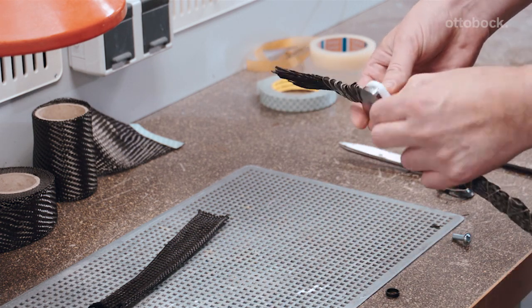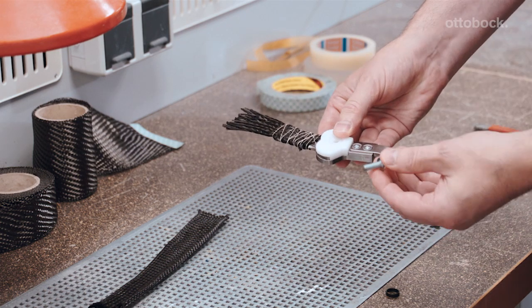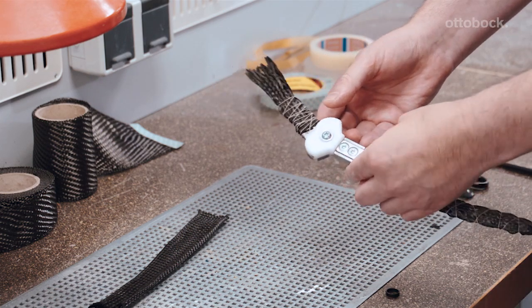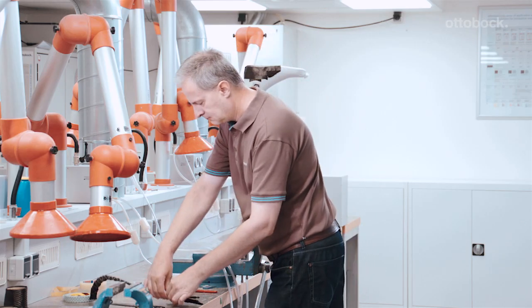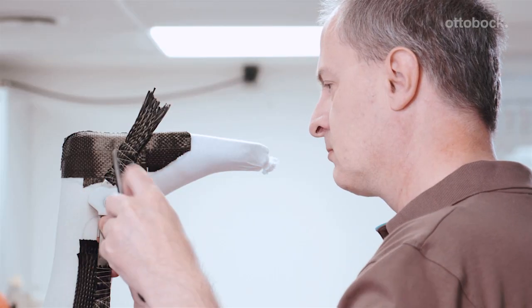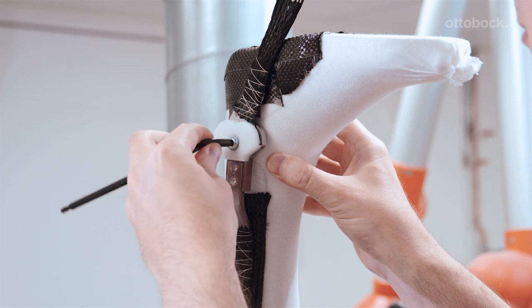Now position the reinforced foot stirrup in the dummy cover. Then place the dummy cover and foot stirrup on the lower dummy section and secure them with the dummy screw. The foot stirrup can be quickly and easily brought to the neutral position thanks to the design of the dummy cover. Next, the lower dummy section and dummy cover are mounted on the plaster model together with the bar and the foot stirrup.